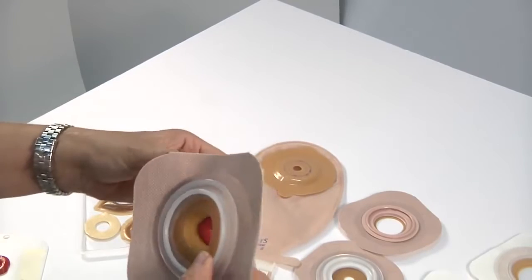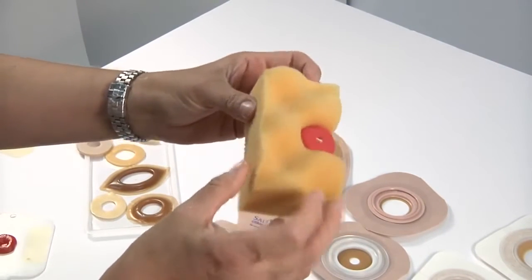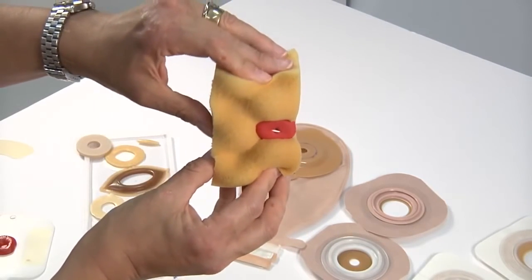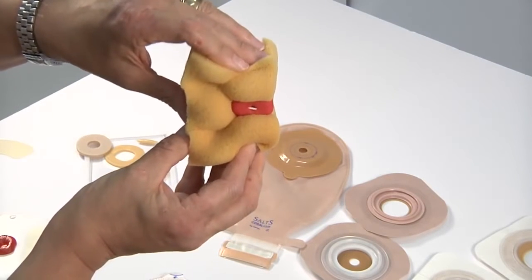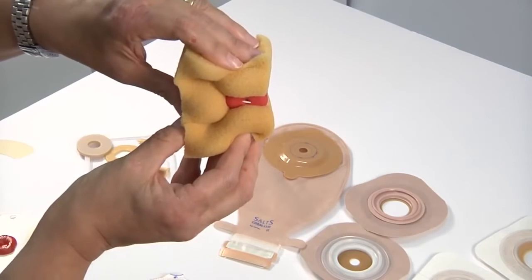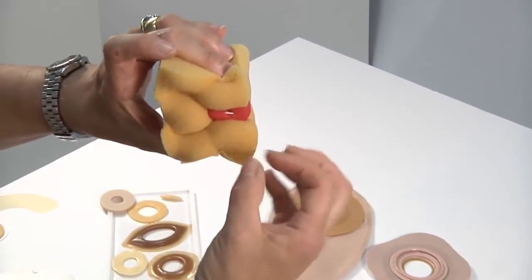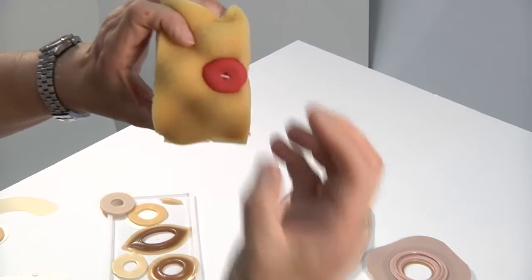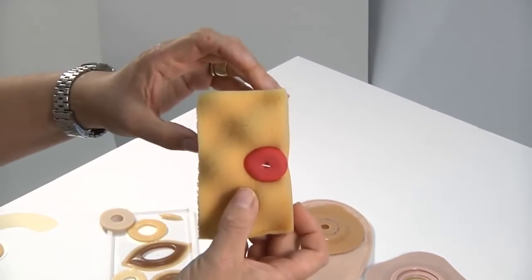So right away you know that you're going to have to compensate for that with some degree of convexity. And when the patient sits upright, as I mentioned, compared to when they're lying flat, it may actually distort even more. You might start to see that their stoma fold or their skin folds will crowd around the stoma, and that their stoma disappears inside of that. So again, with convexity, what we're hoping for is that that's going to open up and the stoma is going to be able to stick out, and you flatten those peristomal planes a little bit to make your seal more predictable.